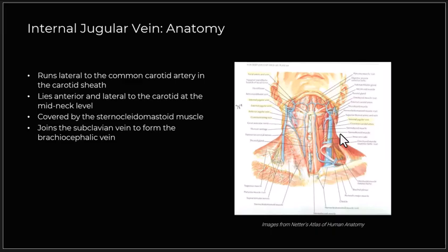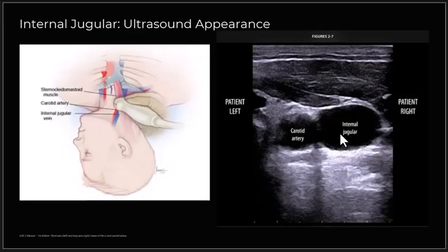Now, typically, we position ourselves at the head of the bed, looking down towards the patient's feet, something that looks like this setup. When I'm standing at the head of the bed, facing towards the patient and looking towards their feet, I keep my indicator pointing to the patient's left. I also keep it pointed to the physician's left on most other occasions as well.